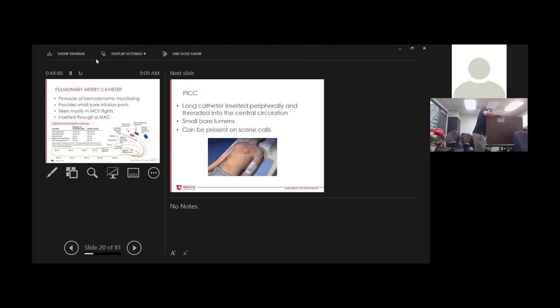After that, you have a third infusion port that's long and skinny. But having never seen this one, I want you to focus on those three things. Securement, volume infusion, never, ever, ever.